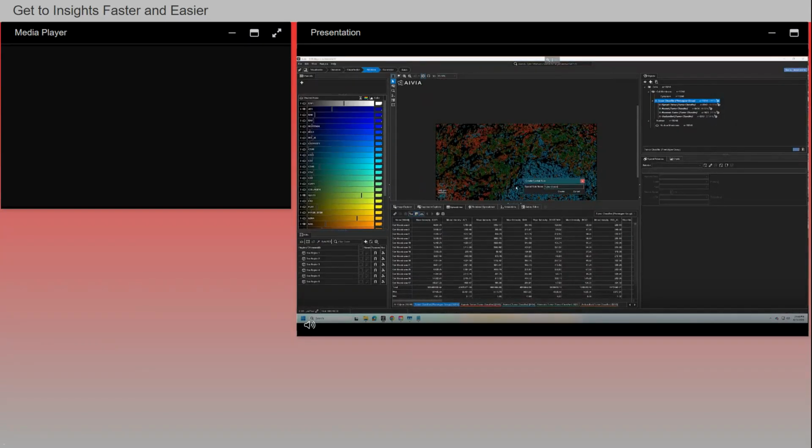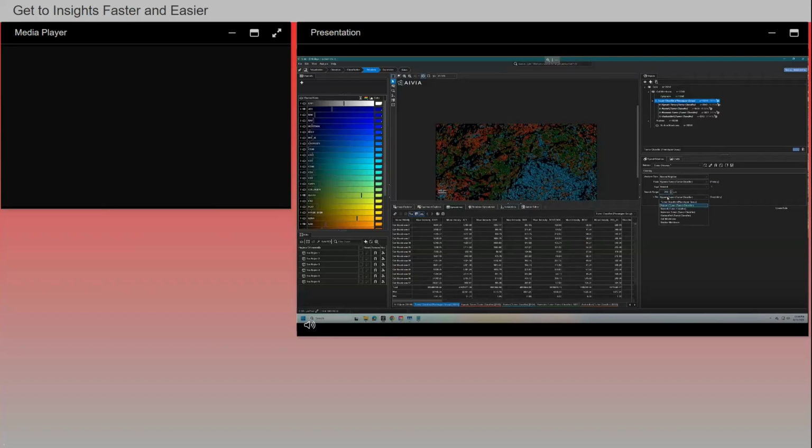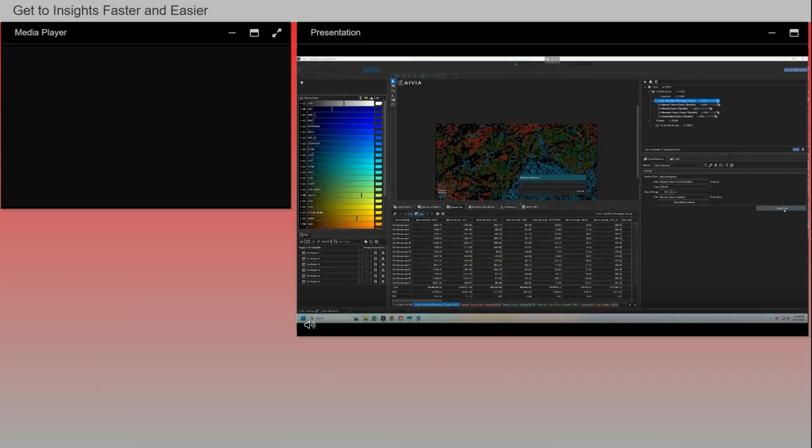So I'm going to do tumor distance relation analysis where I'm going to look for nearest neighbor from a type of tumor, hypoxic tumor, to find the nearest normal cells within 200 micron radius. And I'm going to leave the default measurement, mean distance, and nearest distance. And I'm going to do this measurement.